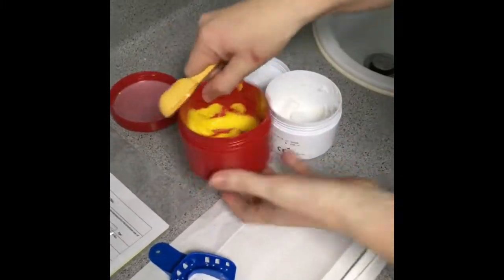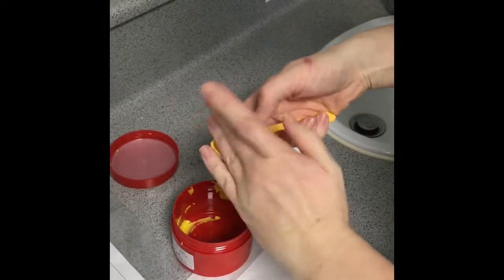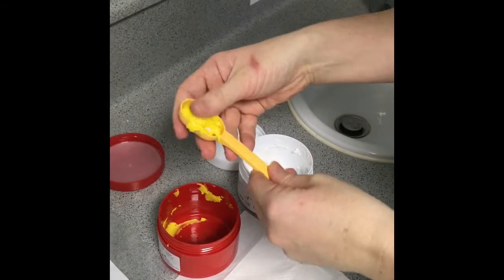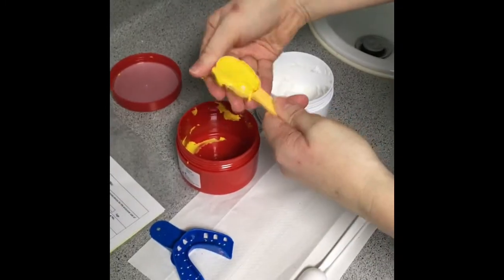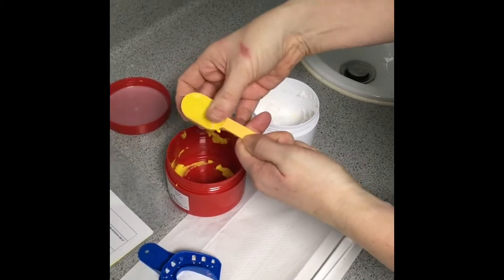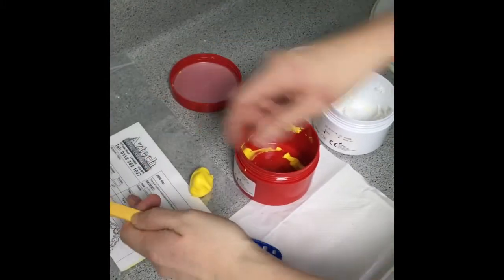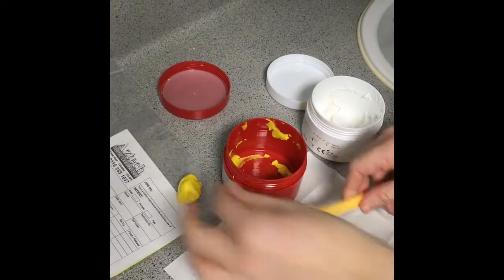The yellow scoop goes with the yellow. Flatten it down to make sure it is completely flat, then pull it out. Sometimes put it on the bag so it doesn't stick — it has an oil in it as well.